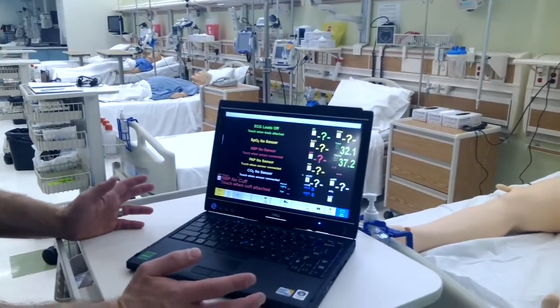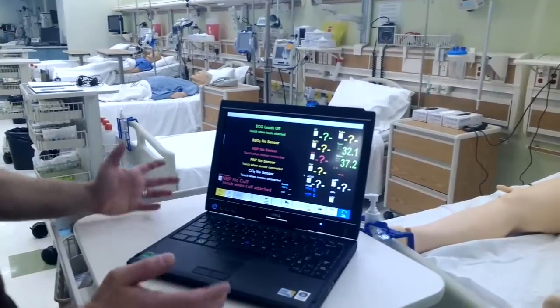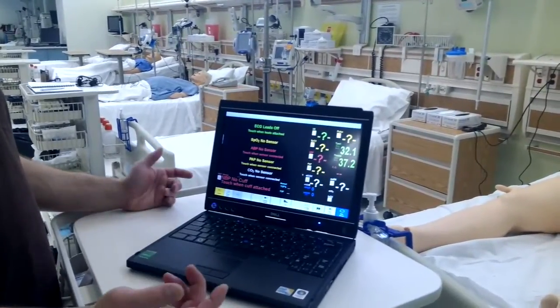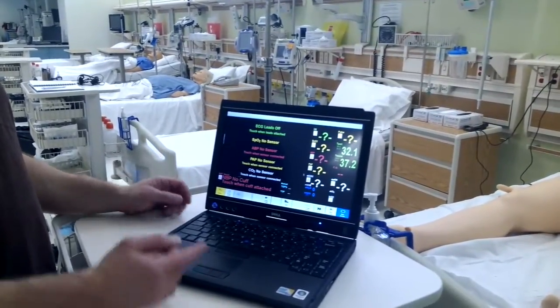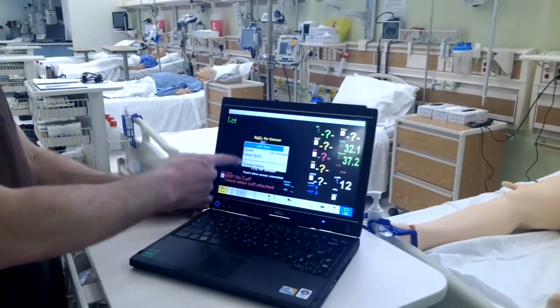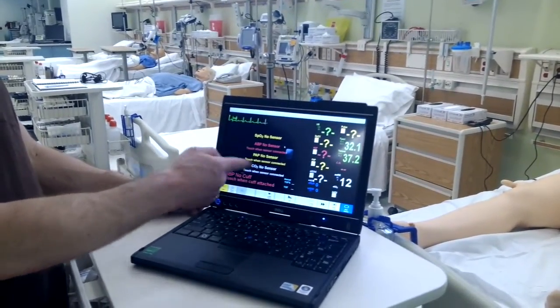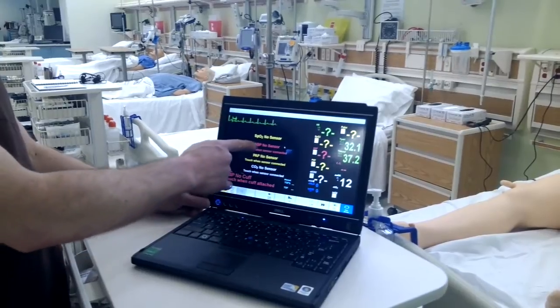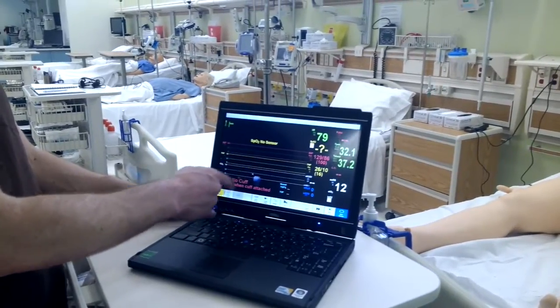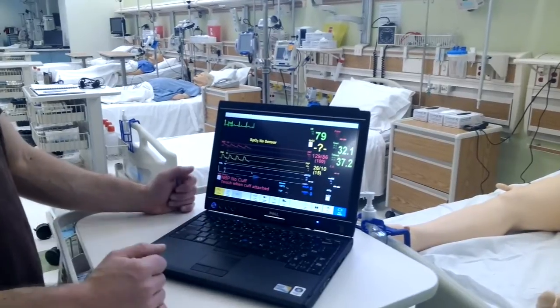Here we have our monitor. This is our default monitor setup. It is touchscreen. SP02 — we're going to talk about O2 SATs in another video. And then we can start all our waveforms.